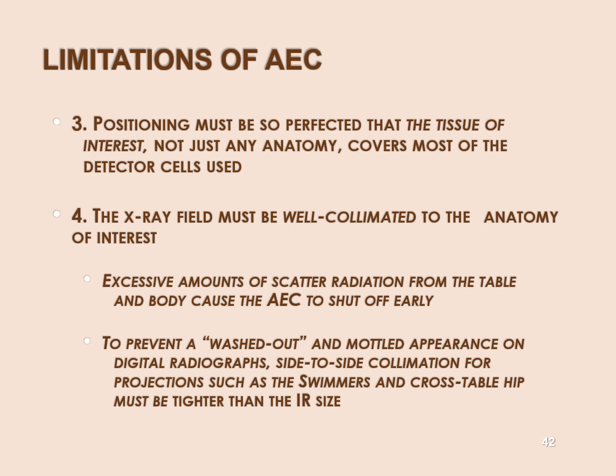So basically we're talking about probably humerus, probably femur, and the trunk. And then maybe center cell skull. I'll give you that. And that's it. Anything below the elbow, anything below the knee, any pediatric patient, you shouldn't be using AECs for that. Okay?